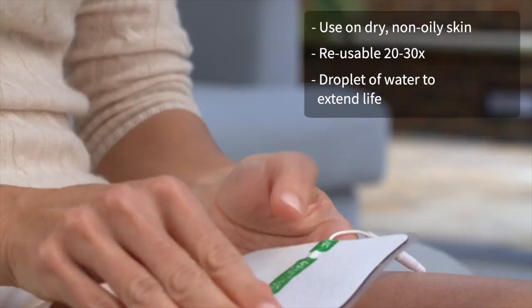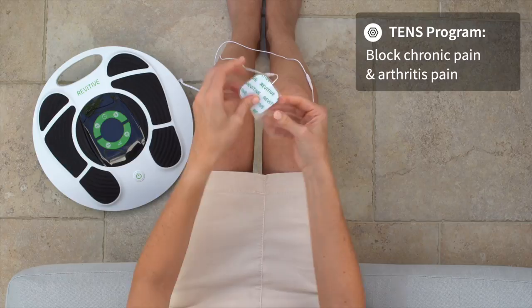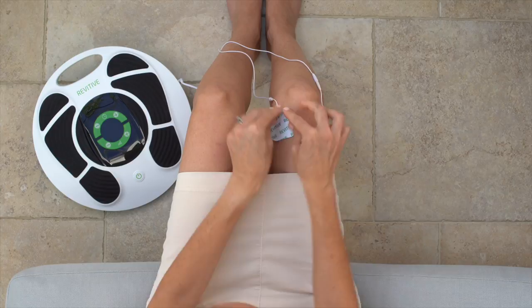Medic Knee also comes with a TENS program, designed to block chronic pain, including arthritis pain. First, connect the smaller body pads to the electrode cord. After removing the plastic liner, apply each pad to either side of your knee joint, or above and below the knee joint.